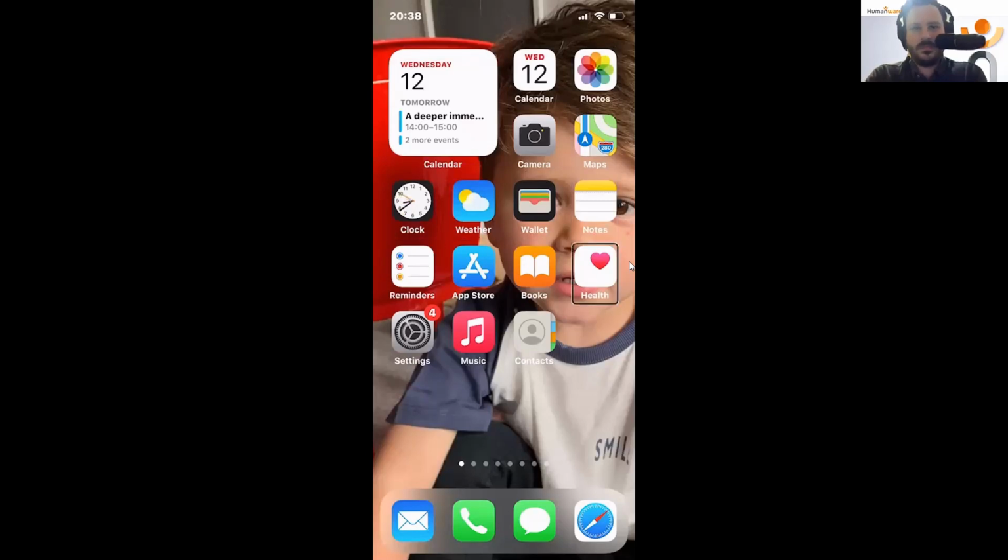Okay, fair enough. So my next thumb key allows me to go to my next item, item by item. And if, of course, I want to go backwards, this is mimicking your swipe right and your swipe left, taking me left and taking me right. I can also use my space with dot 4 to take me forward. Or I can use space with dot 1 to take me back. That's mimicking your left and right swipes. Double tap motions to open.